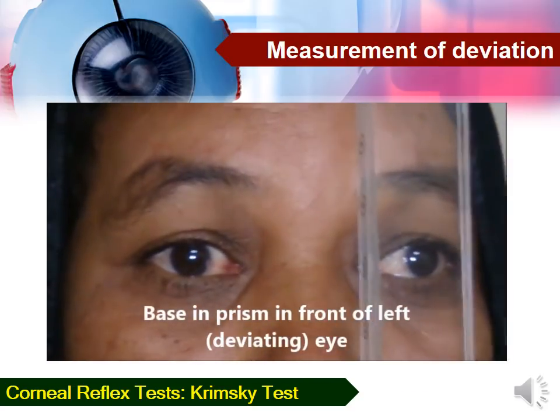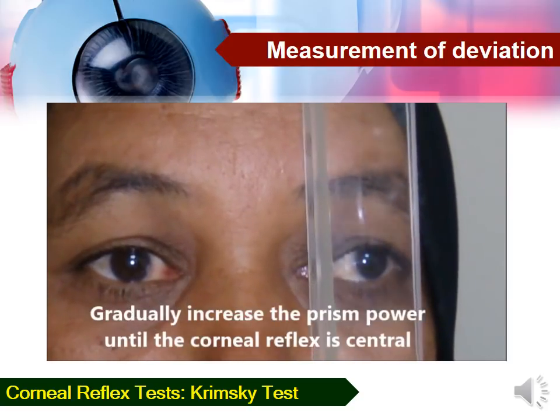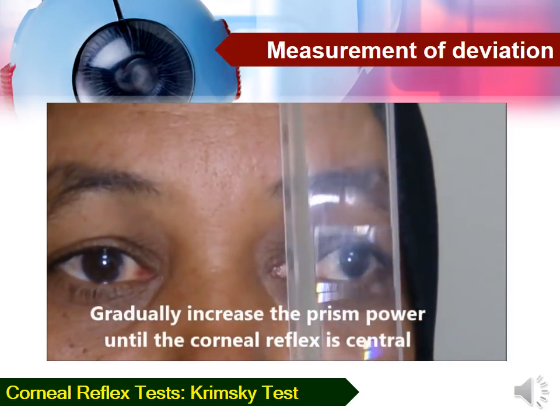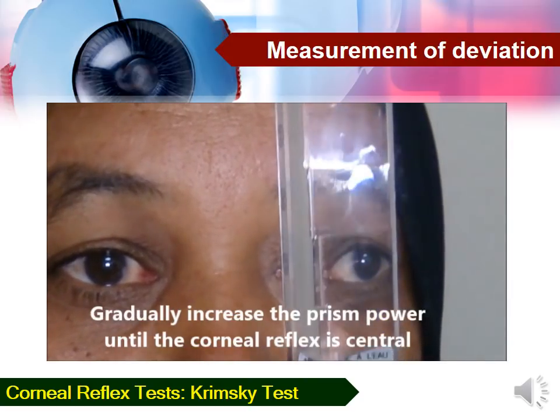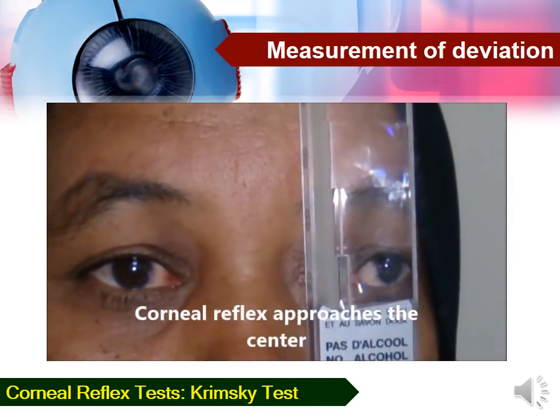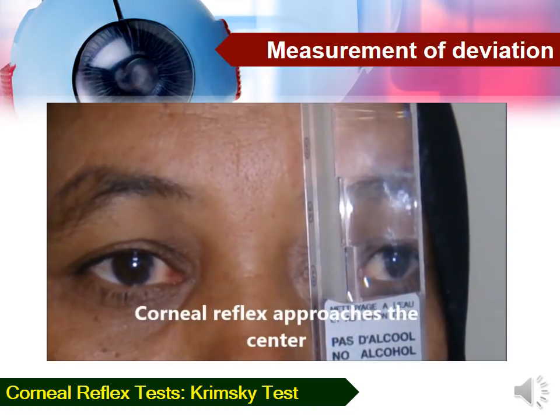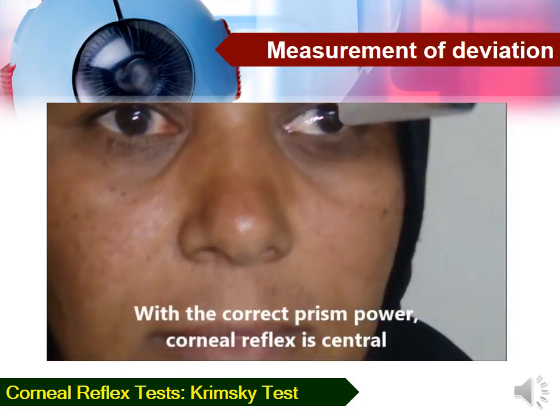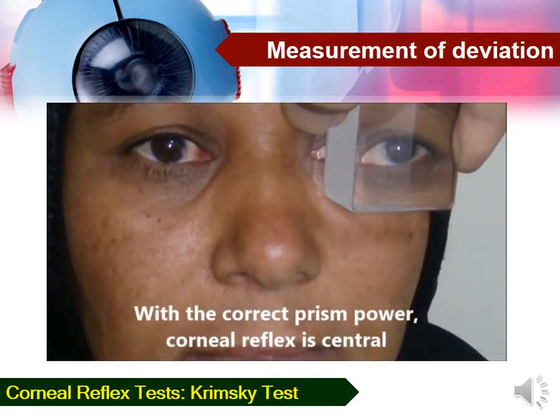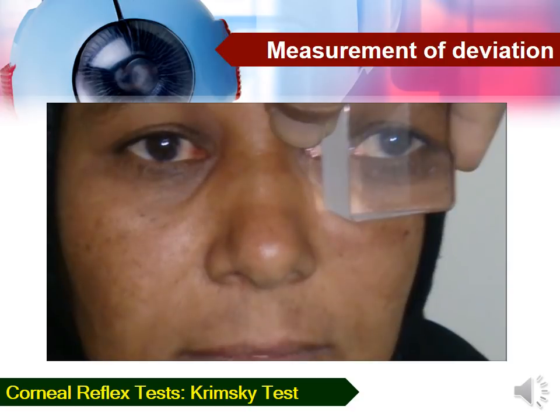This is a patient with left exotropia. We are holding a fixation light approximately 33 cm from the patient. You notice that the corneal reflex is not in the center of the pupil of the left eye, but rather on the nasal part of the iris. We place a base-in prism in front of the exotropic eye. The prism will gradually shift the light reflex towards the apex of the prism, that is towards the pupil center. You gradually increase the prism power, and as you increase the prism power, the corneal reflex approaches the center of the pupil. With the correct prism power, the corneal reflex will be in the center of the pupil and symmetrical between both eyes.